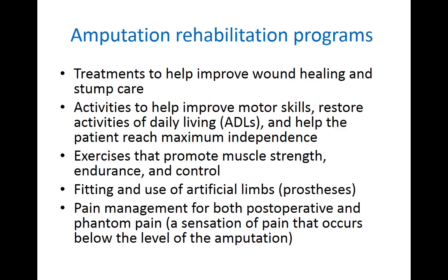As I was talking about the activities to help improve motor skills, these are finer motor functions which require a very important training. Like how to correlate hand and brain function, or how to walk, even the gait. We used to give gait training, because the patient after fitment of a limb has to have a correlation of the entire body in order to perform his activities of daily living.